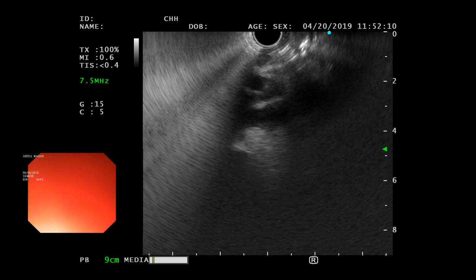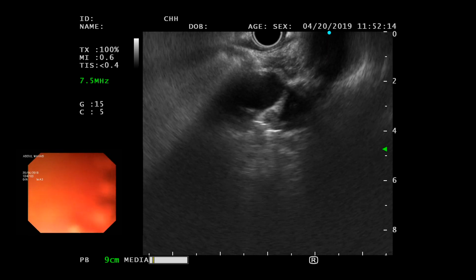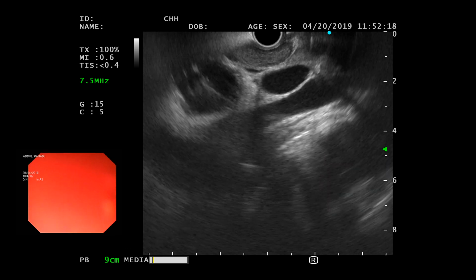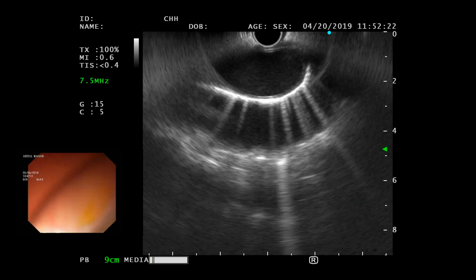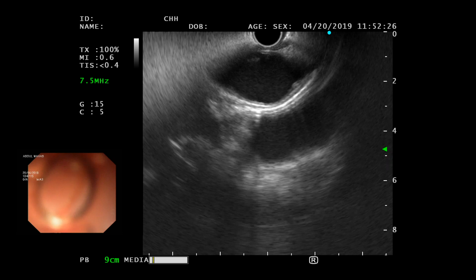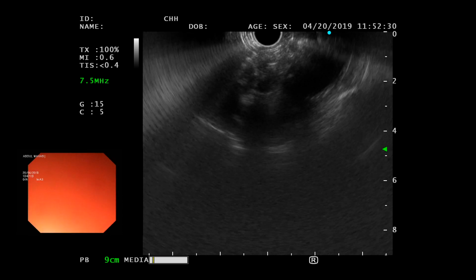Yeah, exactly. So not for malignancy, but for lymphoma. My only concern here is obviously TB. Yes, and in a chronic pancreatitis patient who's obviously not nutritionally so good.